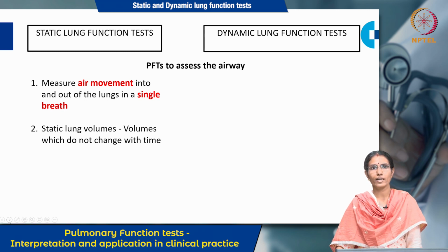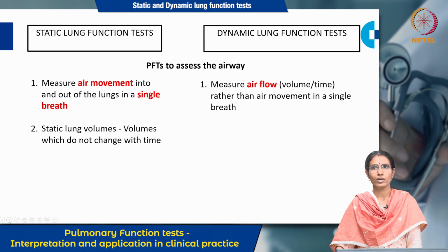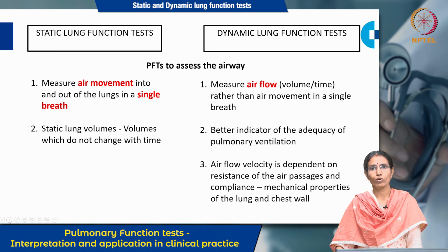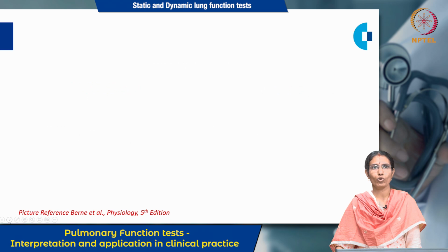What about dynamic lung function tests? What do they measure? They do not measure air movement, but they measure airflow. What is airflow? Volume per unit time. And the airflow velocity here is dependent on the resistance of the air passages and the compliance, which are the mechanical properties of the lung and the chest wall. Hence, this serves as a better indicator of adequacy of pulmonary ventilation. So let's see about these different static and dynamic lung function tests in this module.